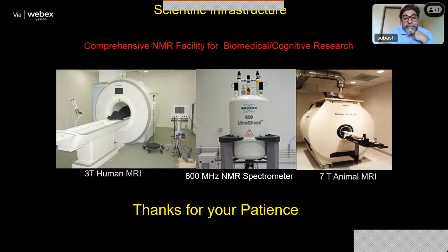And these, for your reference, are 3 NMR machines. On the left hand side is a 3 Tesla human MRI system, which was there at INMAS where I worked till 2019. And on the right hand side is a 7 Tesla animal MRI from Bruker. This is a very powerful magnet, and it can do micro imaging. The resolution can be of the order of maybe 100 micron or so. And this is essentially for imaging of small animals like mice, rats, and maybe rabbits.